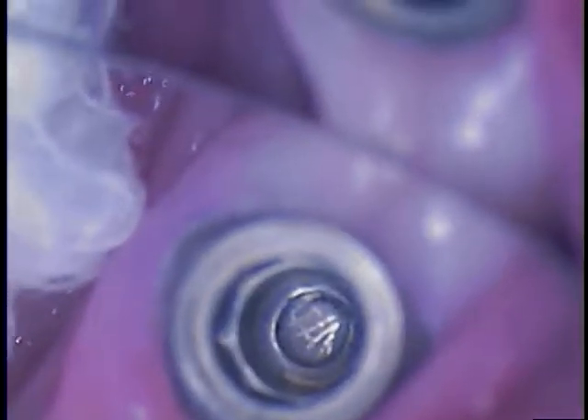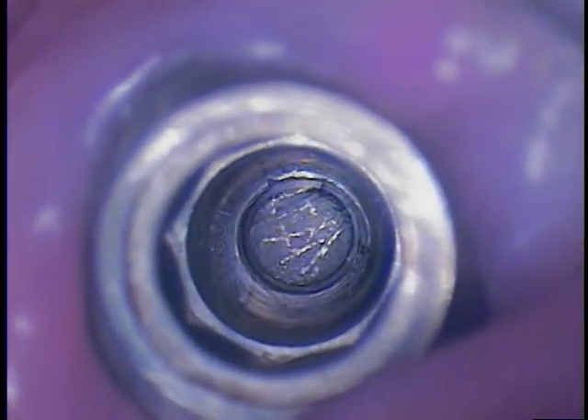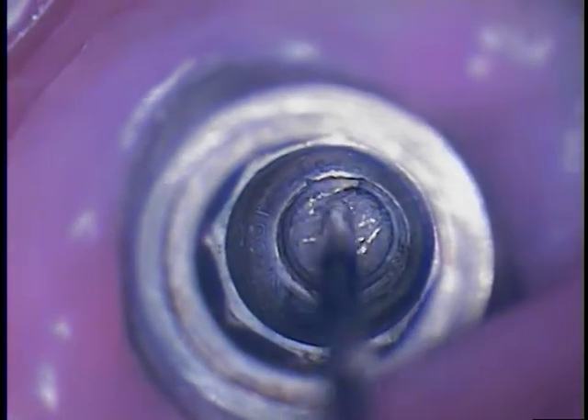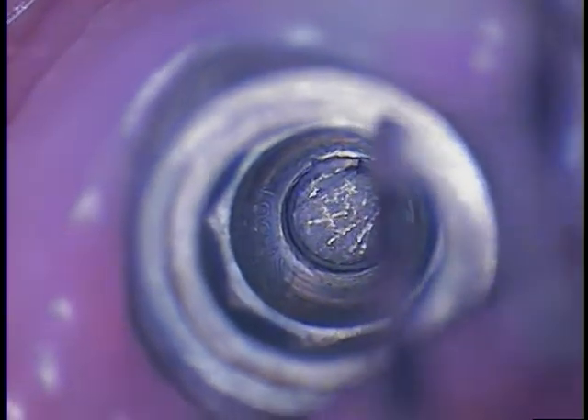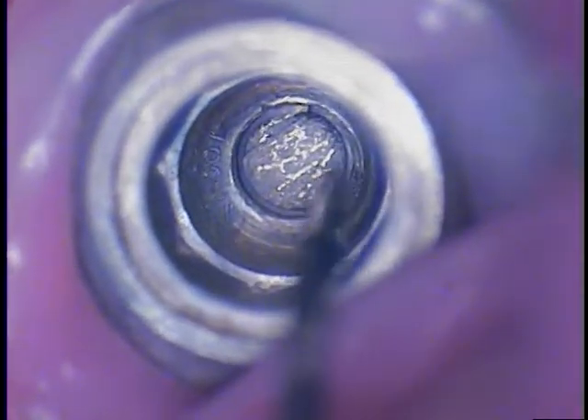I'm going to point that out with a periodontal probe. It is located toward the lingual, mesial-lingual aspect — right there. I want to confirm right now that we do have a mobile screw fragment. I touched it and it did move, so that's good news for our patient. The question is, can we get it to come out? Is there a top portion of the fragment?